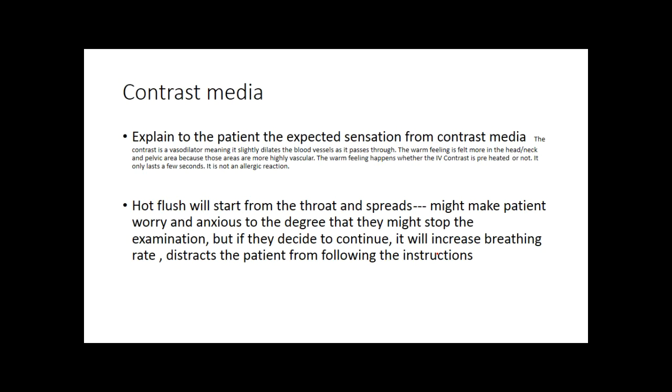While other textbooks recommend telling the patient about the hot flash or the bad taste in the mouth from contrast media, because if they get it and they don't know what it is, they will be afraid there is something wrong. It's not normal to have this feeling, so it might disrupt your examination. For my personal preference, I prefer to tell the patient in a way that they are reassured, not in a way that they are made afraid.